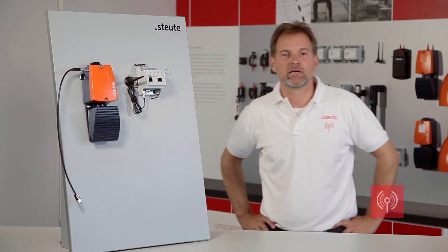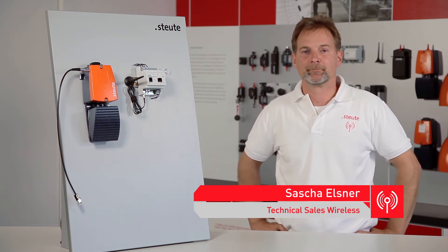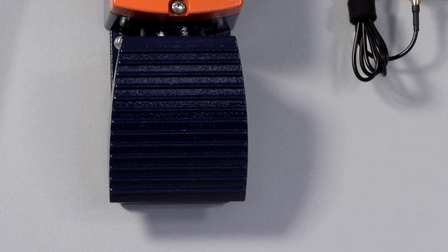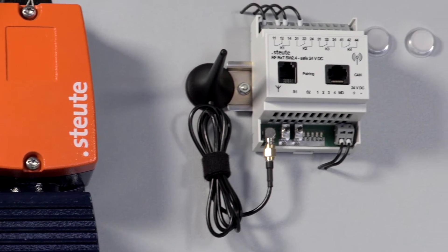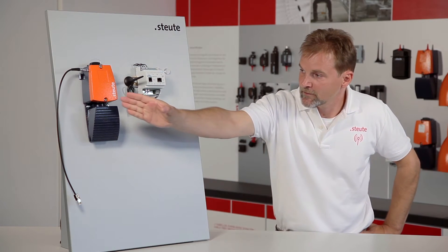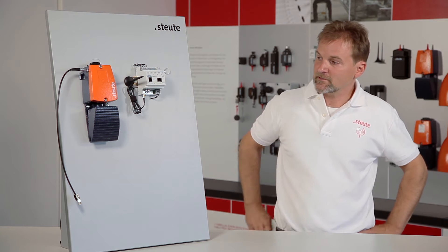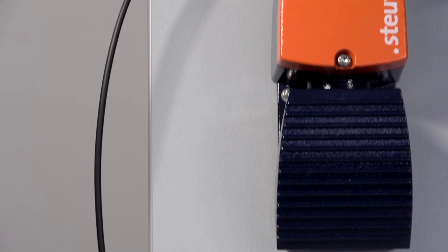Hello. In this video I would like to explain the pairing of steute sWave SAFE wireless foot controls. On delivery, the wireless foot controls and wireless receivers in these product sets cannot yet communicate with each other. We have an example for you here. On the left we have a wireless foot control and on the right a wireless receiver. The set also contains a power supply, a magnetic foot antenna and a pairing cable.